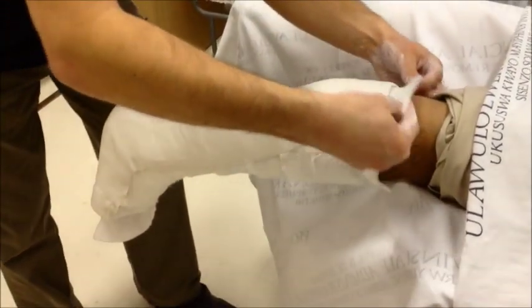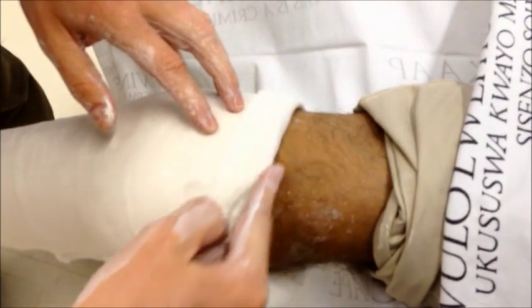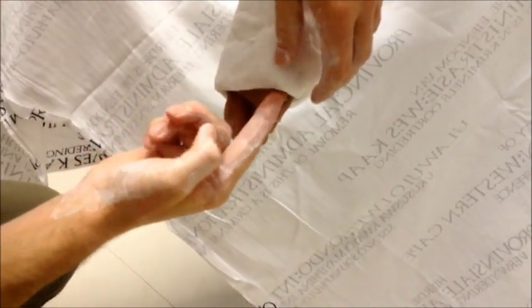At this point, take your skin wool back around your plaster and you'll see that we now have a wool covered edge that's protecting our patient. Do the same down at the toes and you'll see there we have a nice wool covered edge. If you see that you still have a little bit of entrapment into the toe, you can just flare it out.